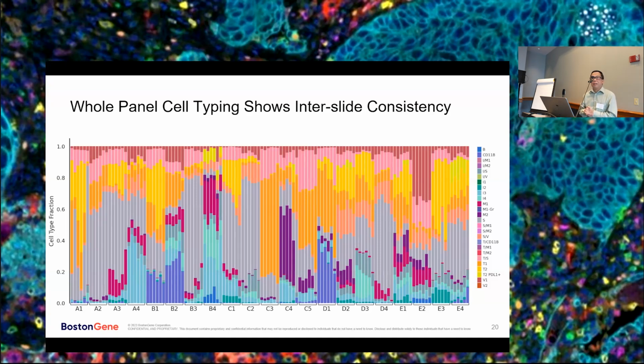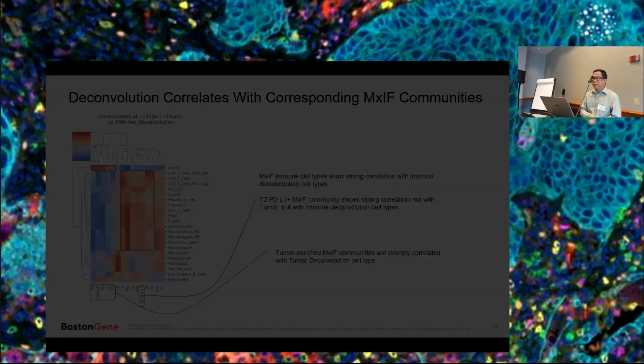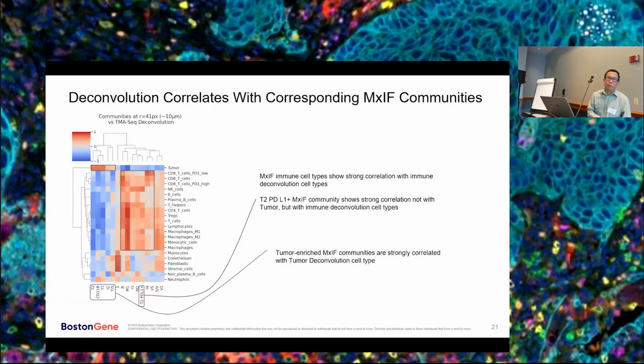One is tissue heterogeneity across the depth of the tissue. Another is different experiments, different probing, different imaging. You are expected to see some changes. And also, the presence of some artifacts might get your data a little bit off. So this is just to show that in a real situation, if you do validation, it could be quite different, quite difficult.